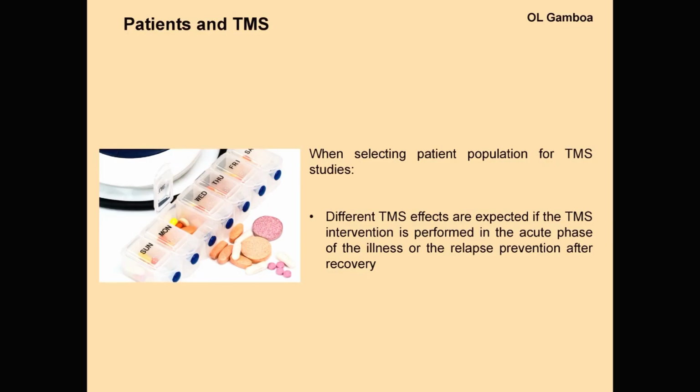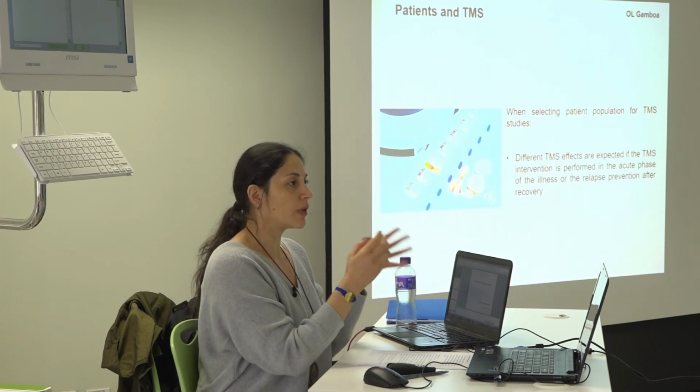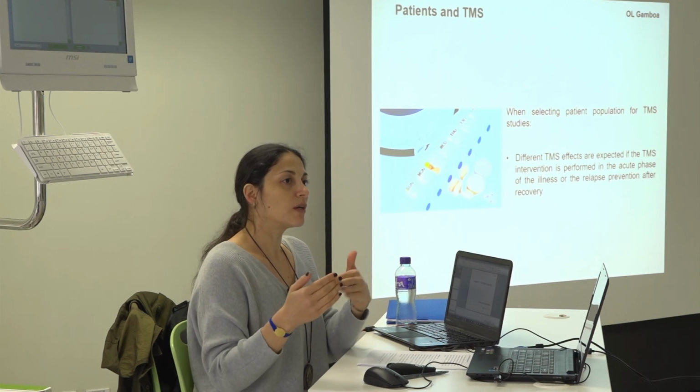This other thing, when you are working with patients, the intervention is different. How the outcome will come if the person is in an acute phase of their pathology, or is in a relapse, or is already recovered, you need to take this into consideration, because the effects will also vary depending on the stage of the disease, the pathology.